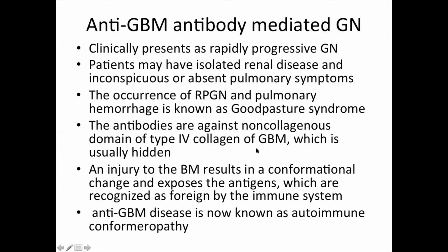All right. So diagnosis, as you guys expected, this is an anti-GBM, antibody-mediated glomerulonephritis, and this is a medical emergency because it clinically presents as a rapidly progressive glomerulonephritis. Almost most of the time, the clinicians are expecting the diagnosis. If their serology is ready and shows anti-GBM positivity in the serum, they are expecting it.